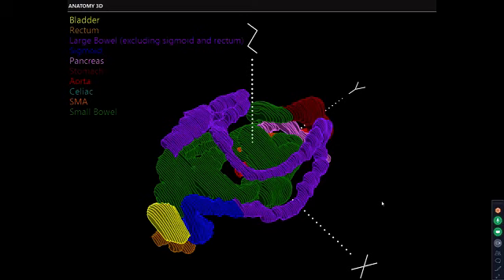But Aaron, what do you say? In your opinion, why do you think the contouring of organs at risk is so important? Well, I would say as a radiation oncologist, I place equal importance on the accuracy of organ at risk contours as I do on target volumes.